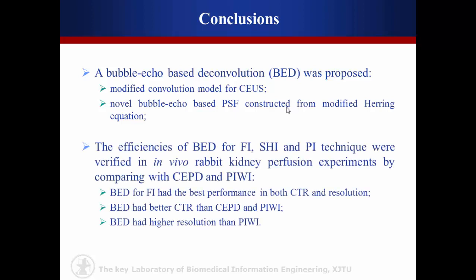And the efficiency of the proposed BED was verified in in vivo rabbit kidney perfusion experiments. BED for FI had the best performance in both CTR and resolution, and it performs better than CEPD and PIWI in increasing CTR, and had higher resolution than PIWI.